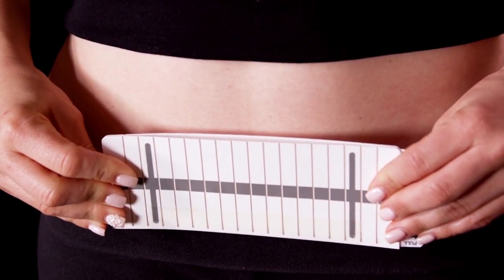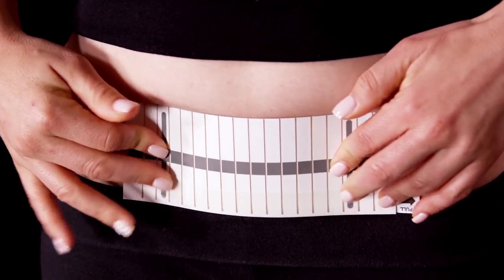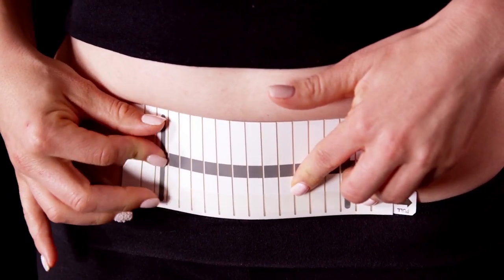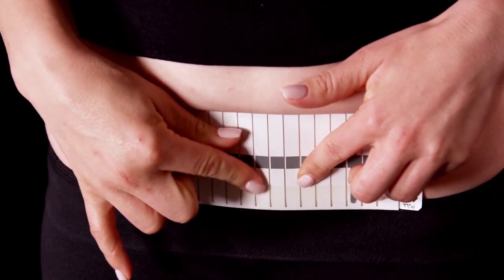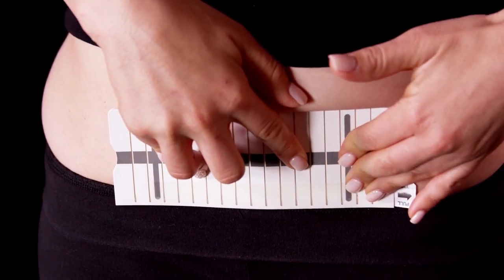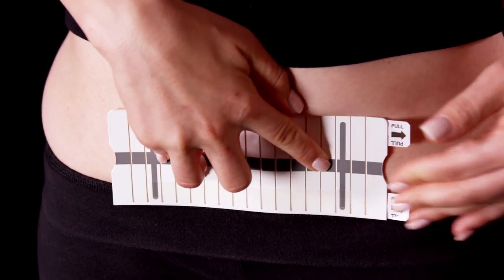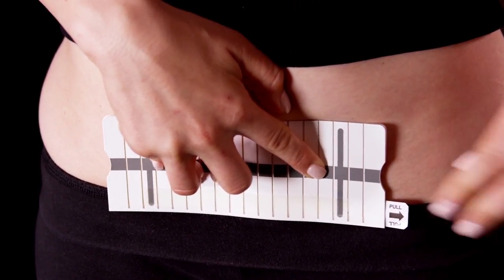Using the dark stripe to help center the dressing over the scar, position the applicator with the dark stripe facing away from your body. Press and hold the dressing on the skin and rub each of the vertical bands on the applicator. Place your fingers along the centered dark stripe and pull each tab to release the dressing from the applicator.